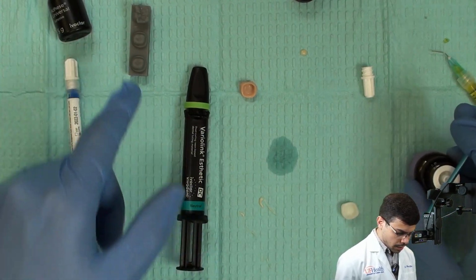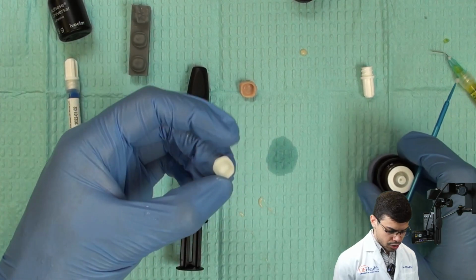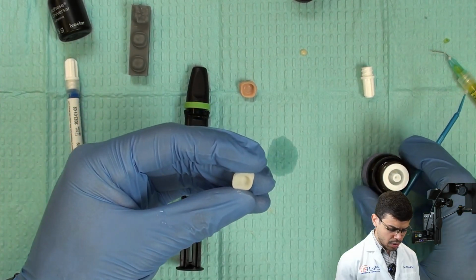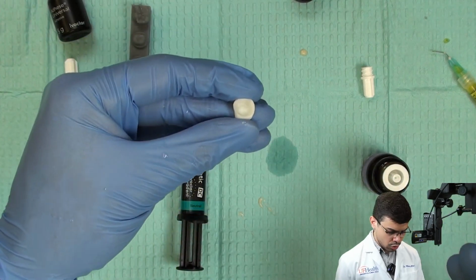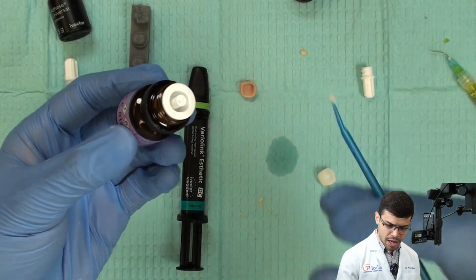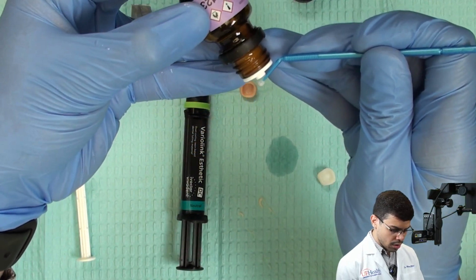All right, since I'm gonna do both crowns with the resin cement, I can start preparing the zirconia as well. For the zirconia, I don't have to etch. It's a polycrystalline ceramic. So I sandblast, which this one came already from the lab, sandblasted. So I try in, I pass Ivoclean to clean the crown.